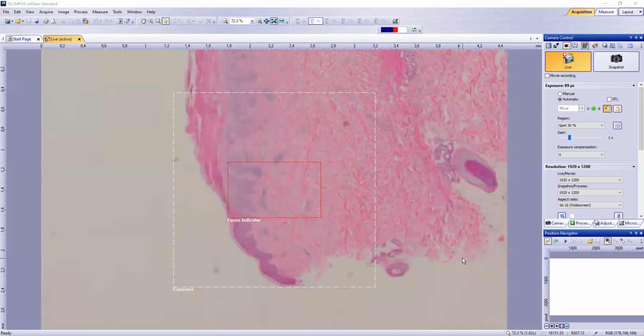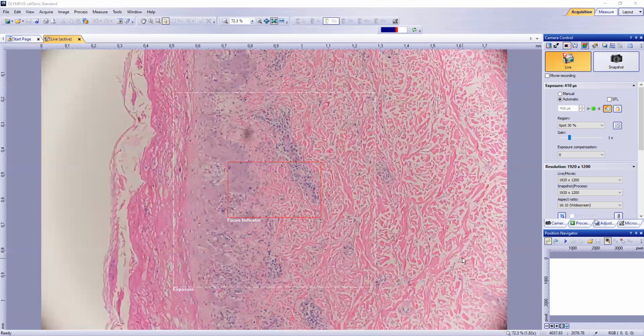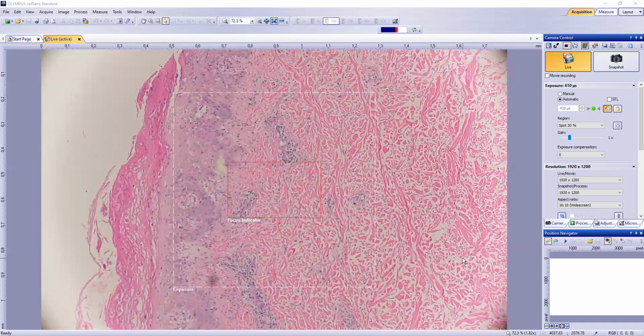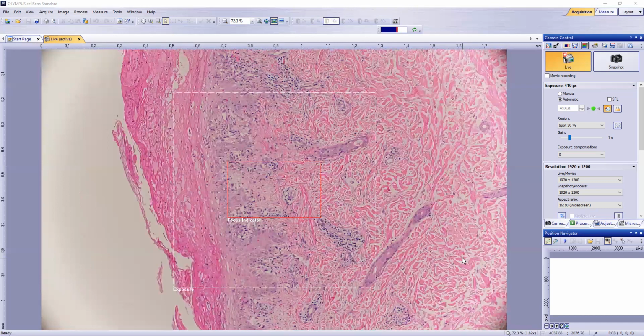Vesiculation is common in the epidermis, so you'll see vesicles forming in the epidermis. That's common in PLEVA. You can also see it in E. multiforme. It tends not to be as common in PLEVA as it is in E. multiforme, but again, that's not a feature that in practice I've found to be very helpful in distinguishing these entities. So those are really the key distinguishing features between PLEVA and E. multiforme.